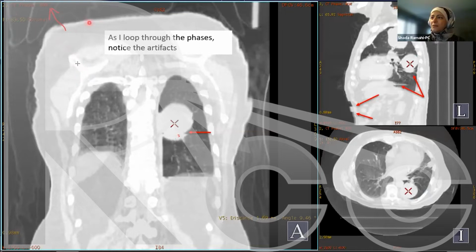Right now you're seeing 80%, and you can see motion artifacts here for 80%. Clearly, no person looks like this. There are no blocks coming out of a patient. So those are due to motion artifacts. And you can see this discontinuity in the diaphragm dome, and also this discontinuity in the tumor over here. This is due to artifacts because of motion. If you see this on the 50% scan, you need to rescan the patient again.